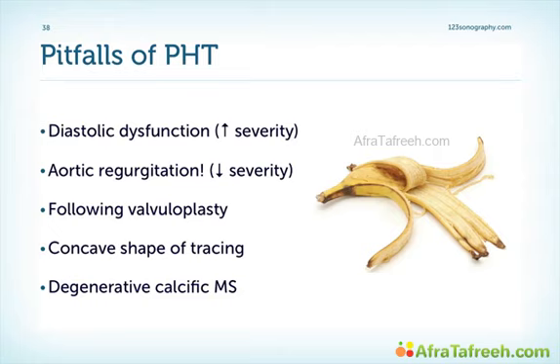One thing which is important to know is that the formula for the pressure halftime was tested in young individuals. We do not know if this formula and the correspondence or correlation between the pressure halftime and the true mitral valve orifice area really is also true or accurate for patients who are much older and who also have additional problems such as diastolic dysfunction and calcified valves.